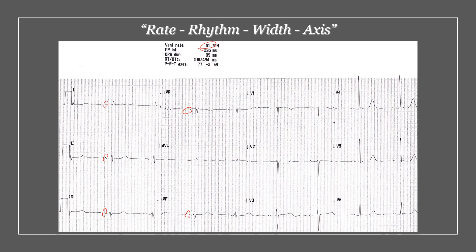Looking at the rhythm, the QRS intervals look regular to me. So I think we've got a regular rhythm here. The complexes are narrow and the axis is slightly leftish. We've got a positive complex completely in lead one and a bit of negativity, so it's heading towards being a bit of a left axis deviation. So: sinus brady and regular rhythm, narrow complex, left-ish axis deviation.